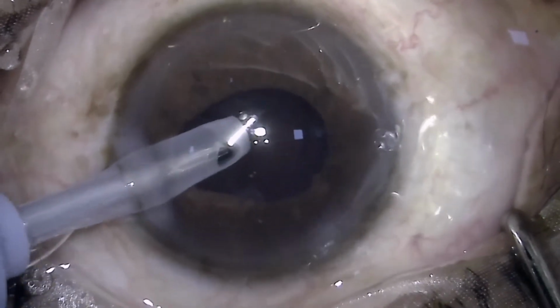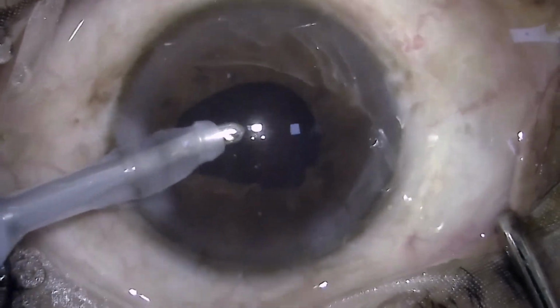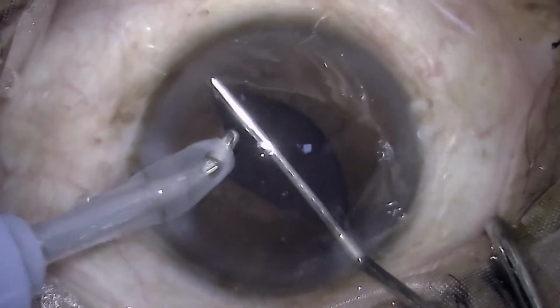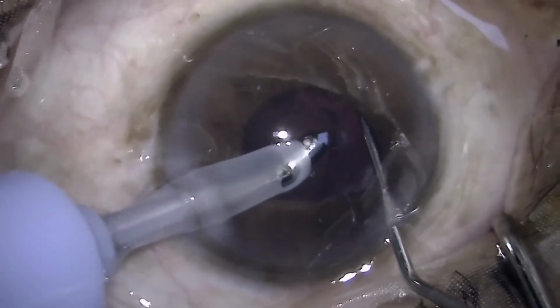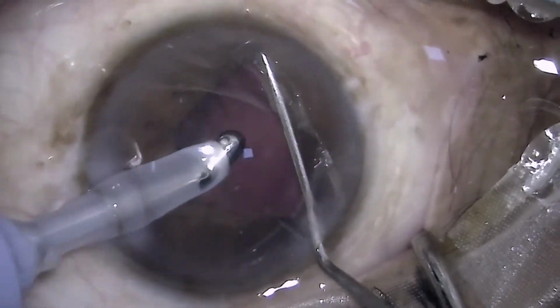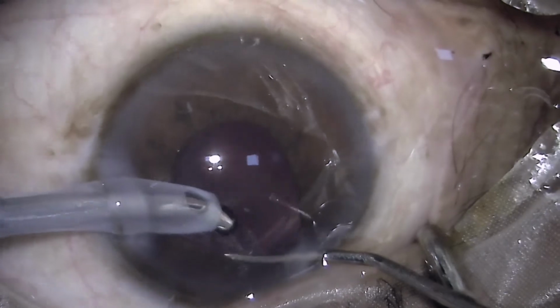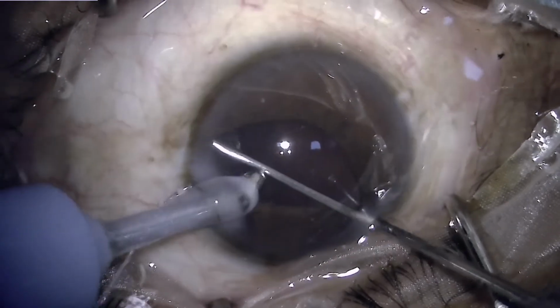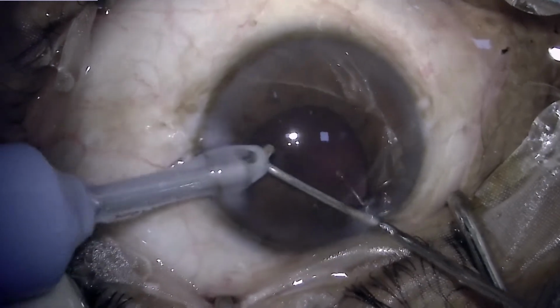Removing the cortex is also a challenge because a fluttery iris gets caught very commonly in the aspiration port, and a poor dilation of pupil means that you'll have to push the iris away just to visualize the underlying cortex, and this process makes the possibility of a posterior capsular tear or anterior capsular engagement quite common. So one has to be very vigilant, very cautious that anything which is apart from the cortex is not caught, and even if it is caught, it is not pulled into the center, so as to avoid any PC tear or any zonular dehiscence.